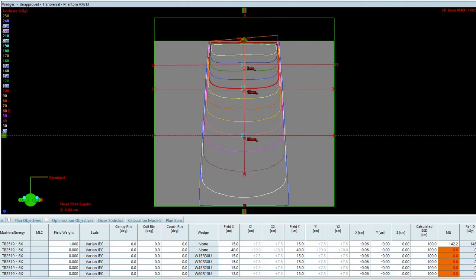The percent depth dose isn't going to change a whole lot. It is going to be higher at depth because of beam hardening. The wedges attenuate the lower energy photons coming out of the machine preferentially, so the percent depth dose increases, similar to how the PDD increases when we use 18x instead of 6x. The effect is there, and it does happen with hard wedges, but a lot of people ignore that effect with hand calcs, especially manual hand calcs with pencil and paper. If you have third-party software like RadCalc or MUcheck, you have the option of inputting those wedge-dependent percent depth doses in.